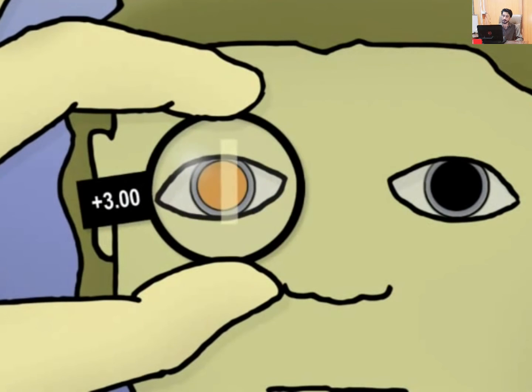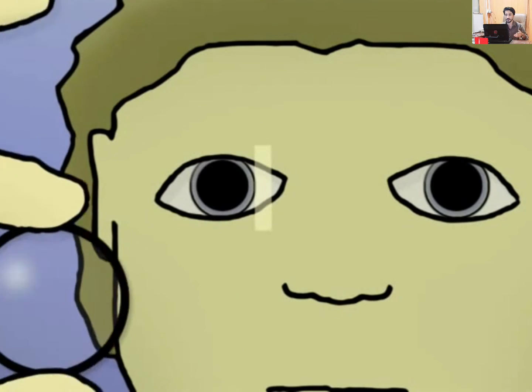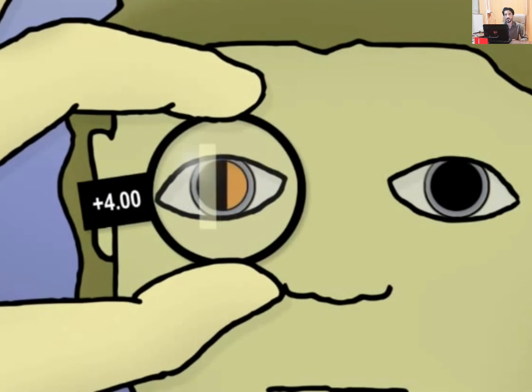This is it. You notice that the whole eye lights up as soon as that light gets over the pupil. This is the perfect focus. And this is the right prescription for this eye. If you go too far, add too much power, then it focuses in the middle of the eye and you get that seesaw, that against motion.